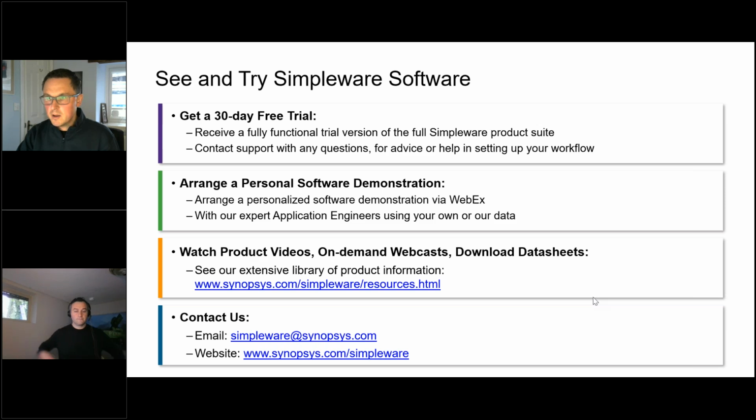So maybe the last question here: do you need custom imaging protocols to build the models from, or can the software intelligently interpolate between larger slice intervals?